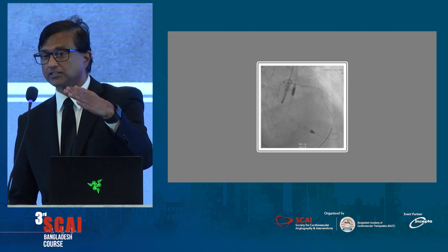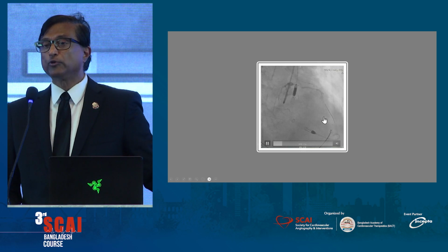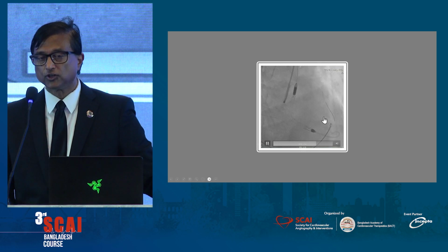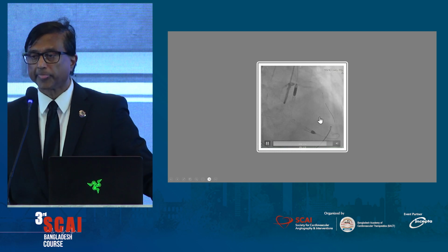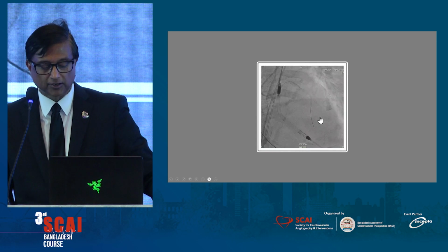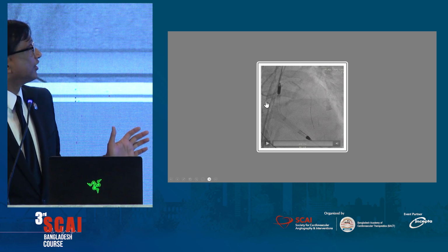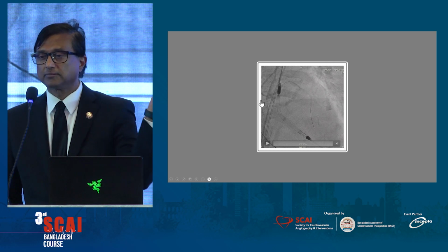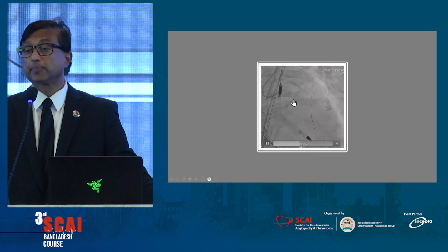So when we are working on the coronaries and making things worse, we should have some kind of supportive mechanism. And I told you yesterday that once the Impella is in and the cardiac output is good, we are very much at ease doing the procedure, with no issues.